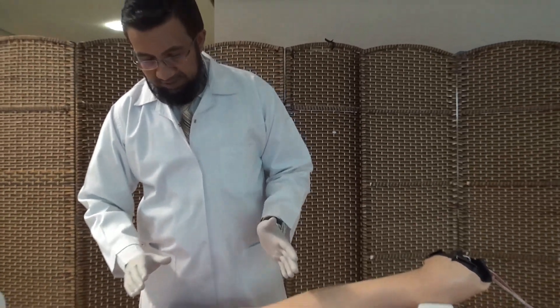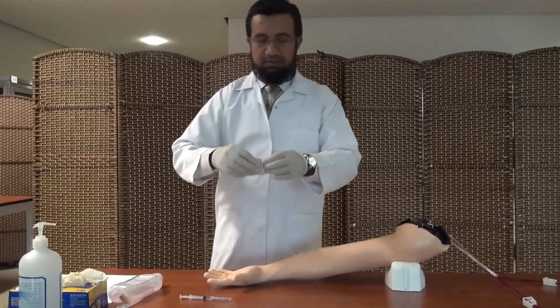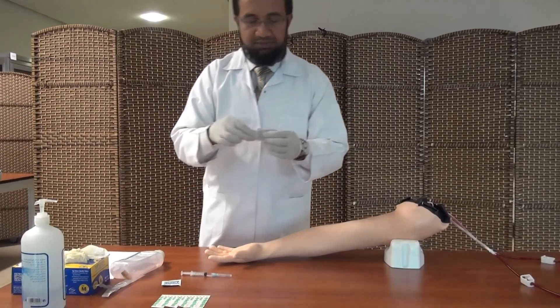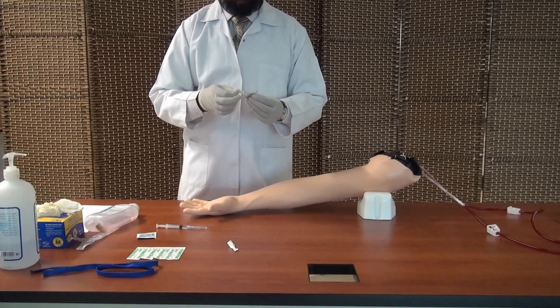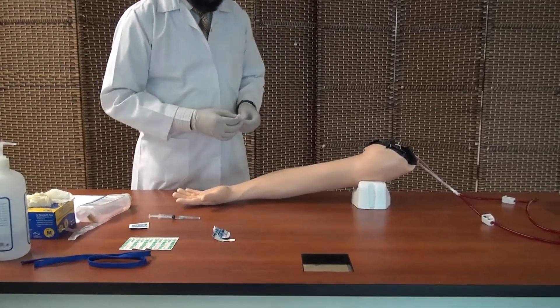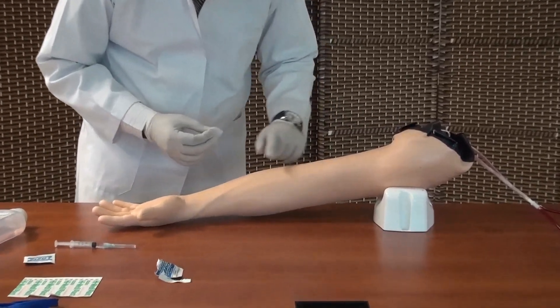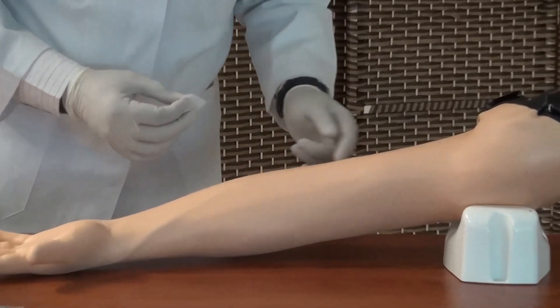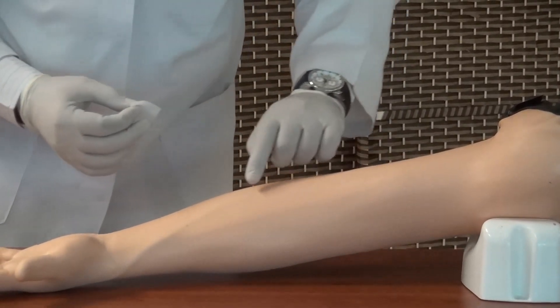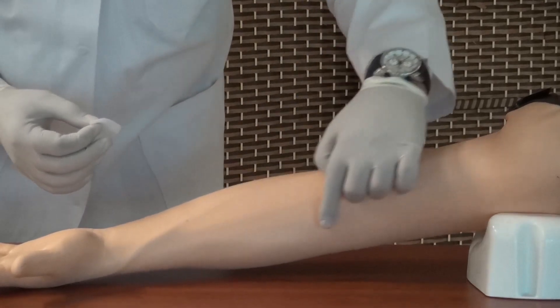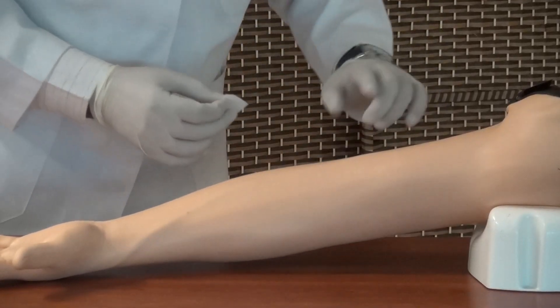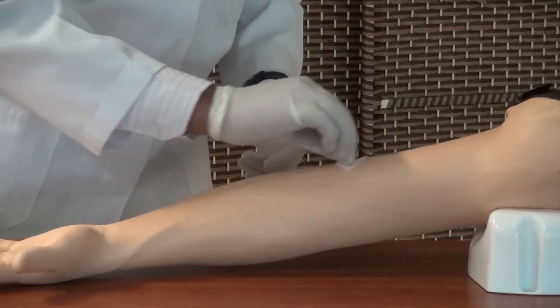Now once we are done, take out one of the alcohol swabs and then try to identify which area you would like to start with. Now we have a few veins pretty visible, one is here, another one here, another one here. For example, if I prefer this vein.